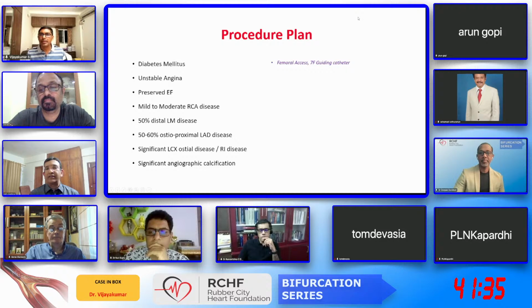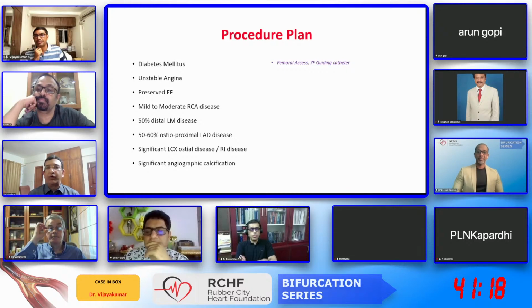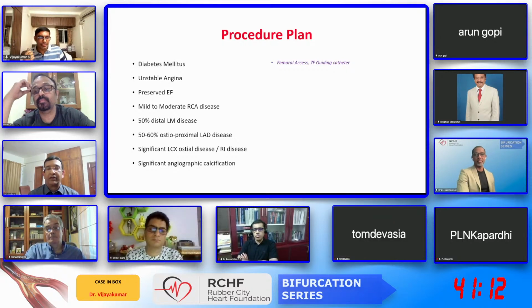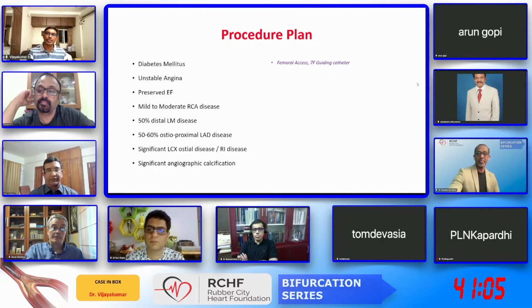Vijay Kumar, can I just ask a question? Why would you ask for surgery for just an ostial LCX? It is a left main bifurcation disease. We all know, again, this side branch restenosis is very common. And if it is a good candidate for surgery, I thought the surgical option also. But that would be only after doing an FFR of the LAD, isn't it? Yeah, absolutely. If the patient is for surgery, again, we have to assess the significance of the LAD lesion. So I'm going to show what we have done.